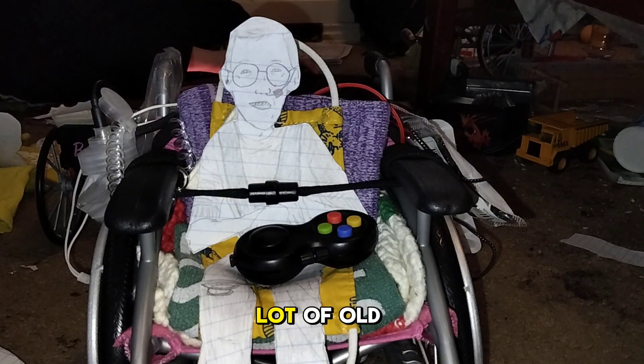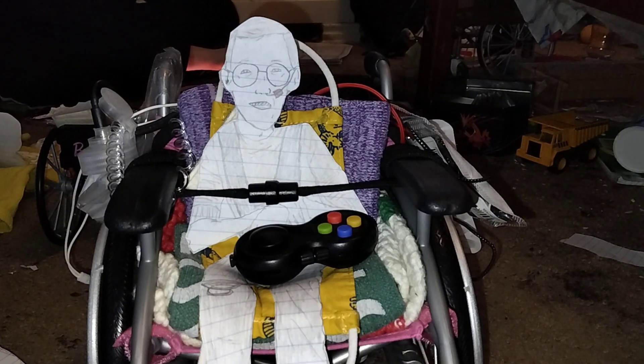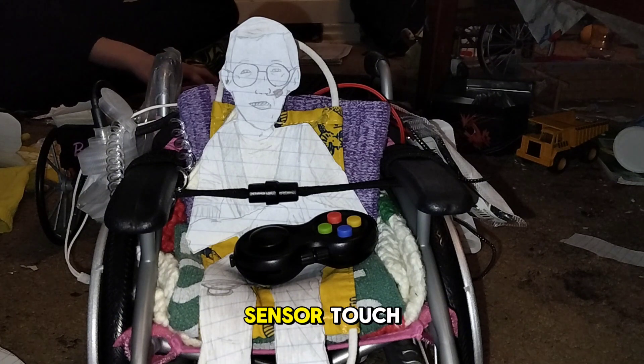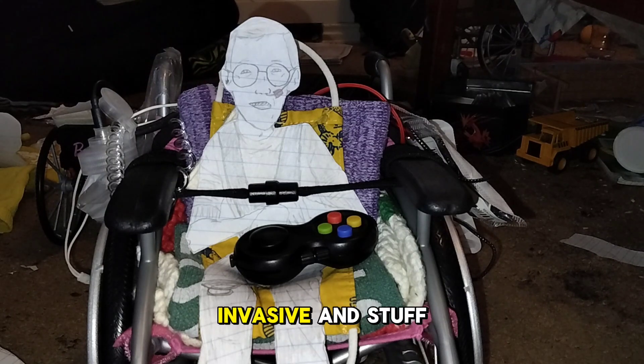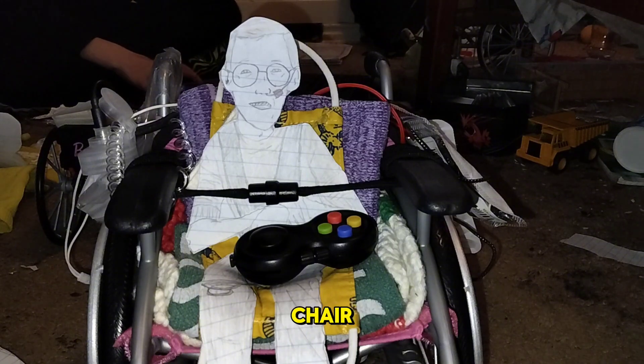Because in a lot of old vlogs you could see my old chair with the little joystick that was more of a sensor touch, rather than the joystick I have in my lap now, which is obviously more invasive and stuff. So we're going to be showing you guys my new chair.